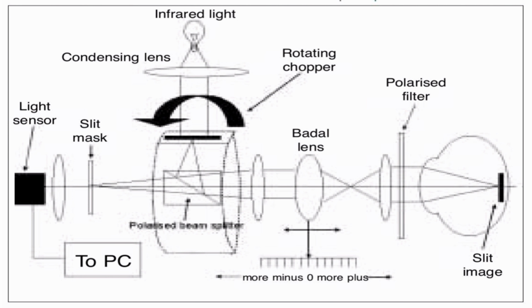Infrared light is collimated. Collimated means the infinity light rays coming give parallel lines, and pass through a rectangular mask housed in a rotating drum. The light passes through a beam splitter to the optometer system. This system moves laterally to find the optimal focus of the slit on the retina. Optimal focus is achieved from the light sensor, and the polarized beam splitter effectively removes reflected light from the cornea, whereas the slit image on the retina passes through the polarized beam splitter.